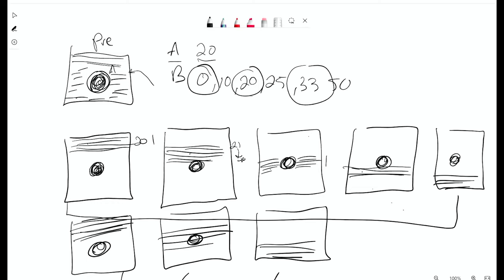And then this is happening per slice. Per 3D volume. Per volume. Yeah. So that means, is it averaging it out at the end once you get 100% K-space? Yeah. So it's not averaging it out. It's making it to where that would be like if your patient swallowed halfway through your cervical spine. Right. So we're making it to where, in this case, they have five phases to screw it up. In this case, they have three.